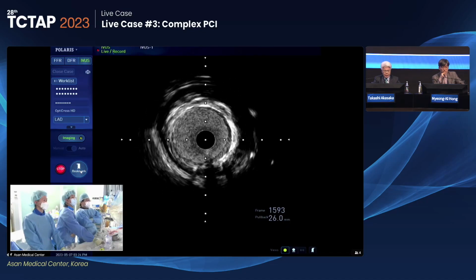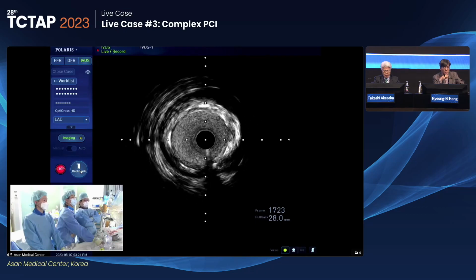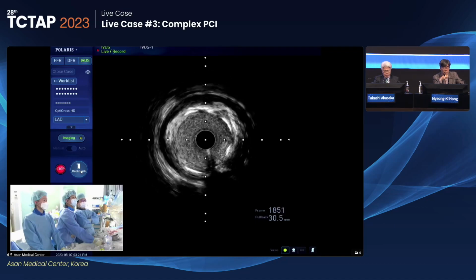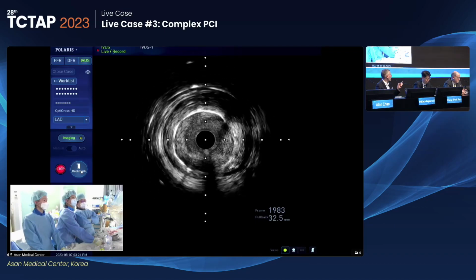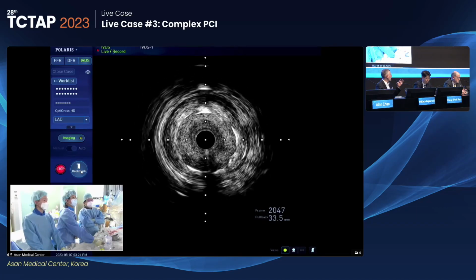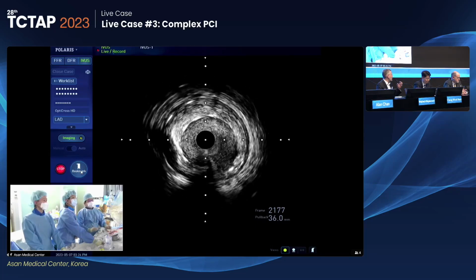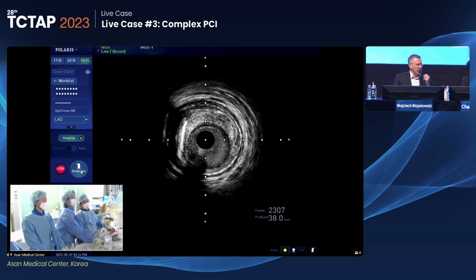At the same time, he has a long stent in the RCA, and the clinical characteristic is not like promoting very rapid neoatherosclerosis. So maybe because this is a focal disease, it is rather a mechanical problem in this proximal part, like the peripheral calcium, or the proximal edge of the stent was in the plaque at the time of implantation.